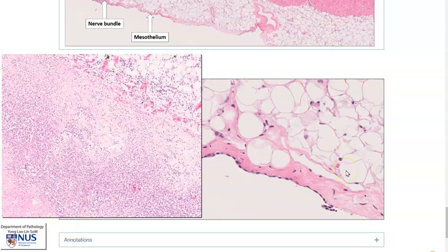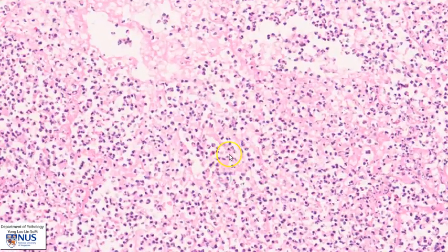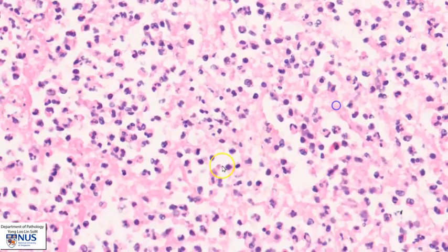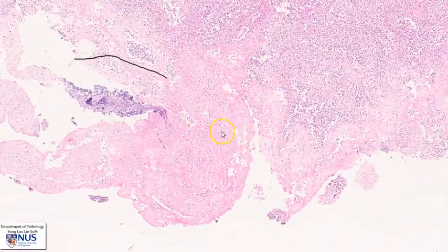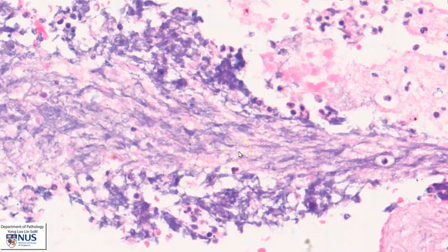Let's return to the virtual microscopy slide. Here in this virtual microscopy slide, we are focusing on this area, which shows the acute inflammatory purulent exudate within the pericardial sac. This inflammatory exudate is composed predominantly of neutrophils. We can see the multi-lobed nuclei of the neutrophils. Many of these are still viable or alive, and some of them show degenerative changes. And we can also see in some areas necrotic cellular debris.